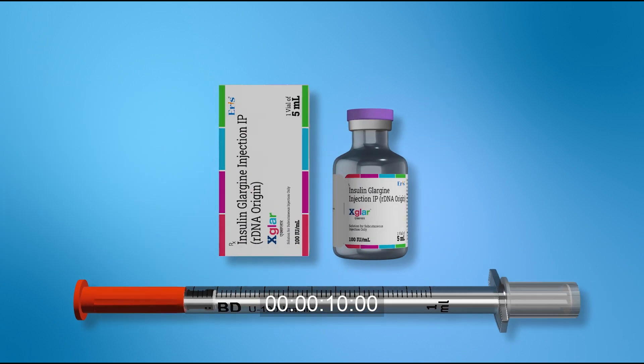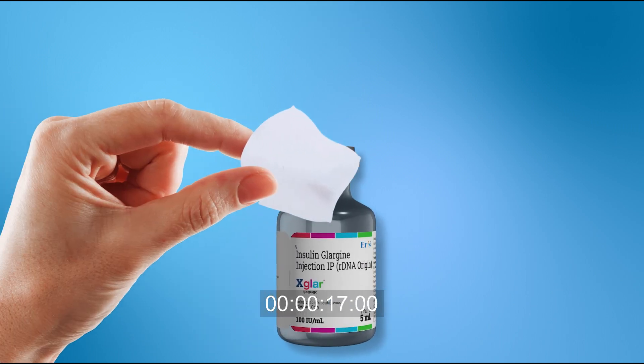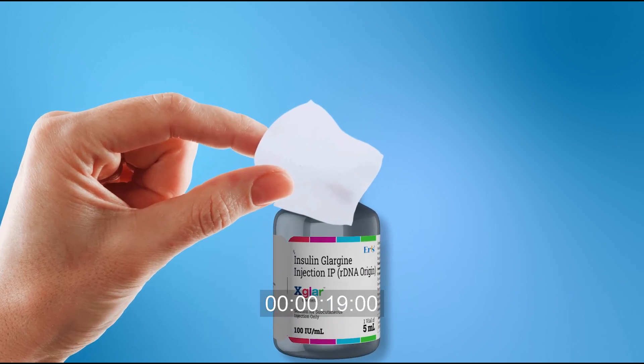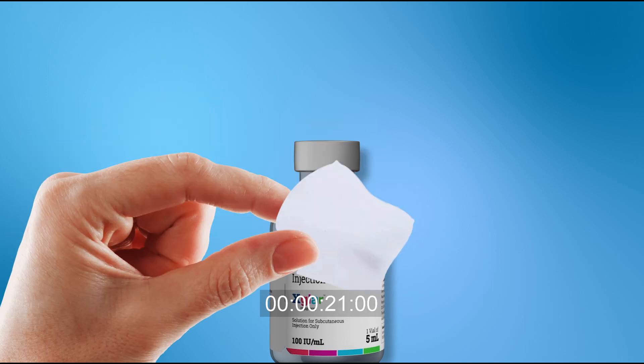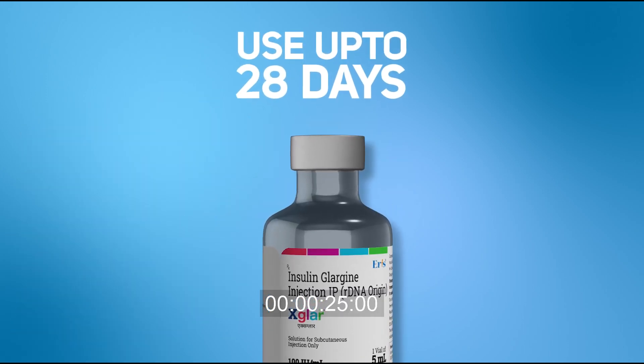Preparing to inject. Always start by washing your hands. Remove the cap and wipe the top of the vial with an alcohol swab. Once opened, vial is good to use up to 28 days.